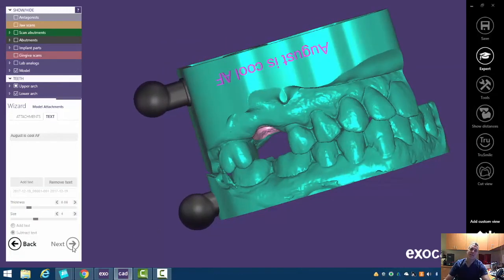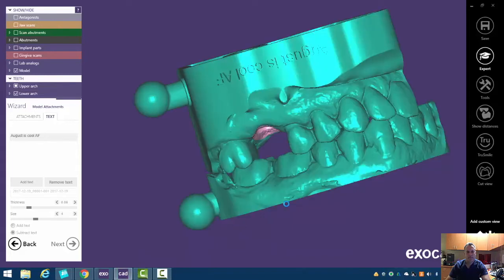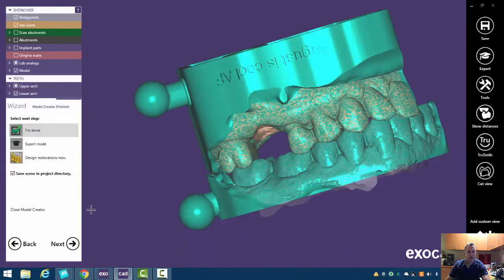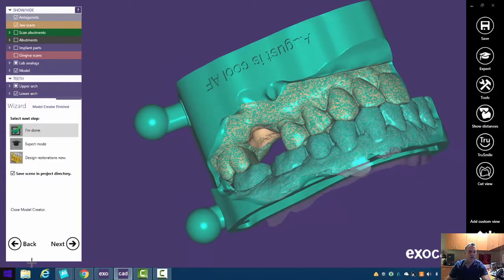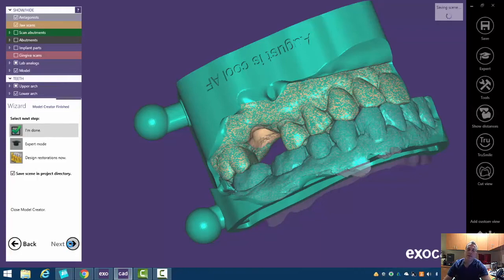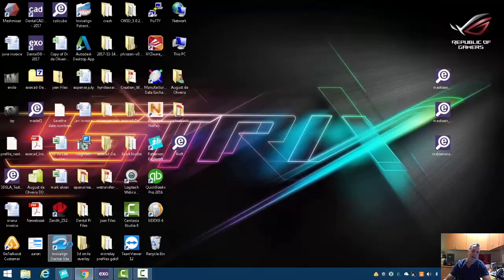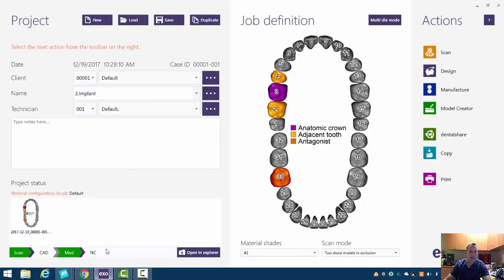All right, when we hit next, it's going to think about it a little bit. And here we're done. So if we go to the actual directory, we should have three models. We'll have an upper model, a lower model and a separate gingival mask.